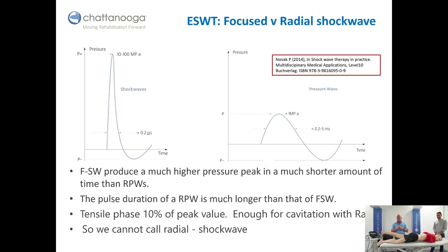We just click on that. So it's not a shock wave. You just left click. No, just left click and it will come up. Okay, so we can't call it a shock wave. If we click again, sorry, I'm not in control of the presentation, my colleague's helping me out here.